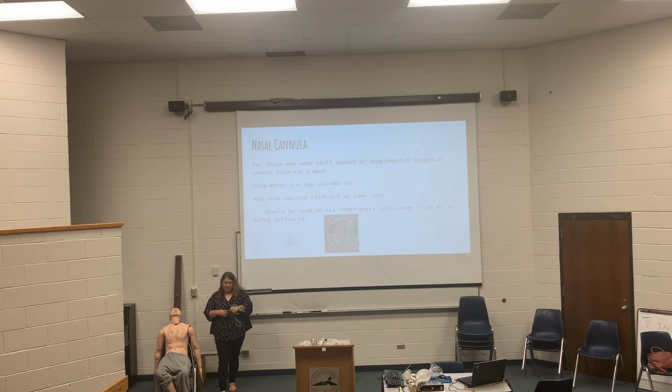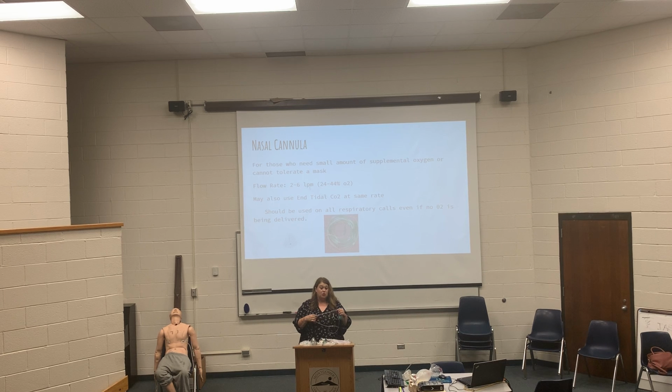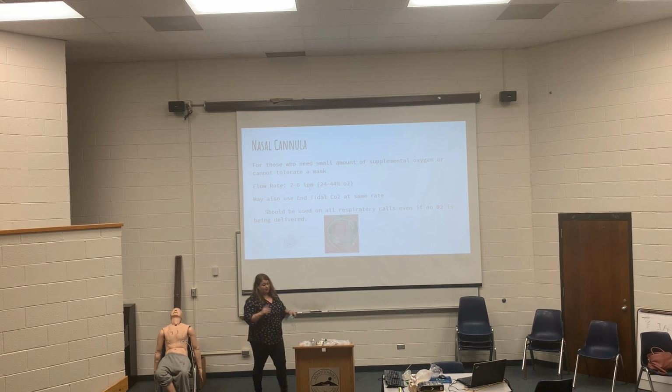I thought that I had a C-collar here, but when we do trauma or next time we use the C-collar, I will show you. There are 2 little notches that you can hook this to, because if this patient has a C-collar on, you're not going to be able to get to their ears very well. So there's notches on the side that you can hook to it. It's very convenient.